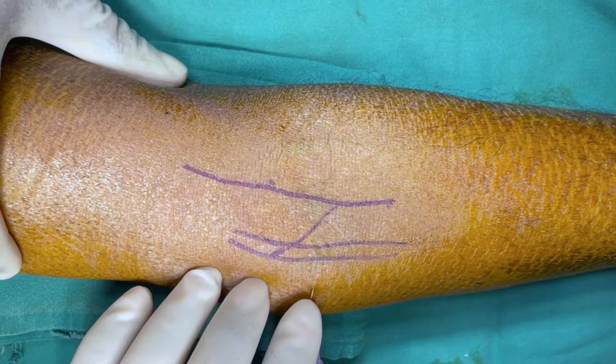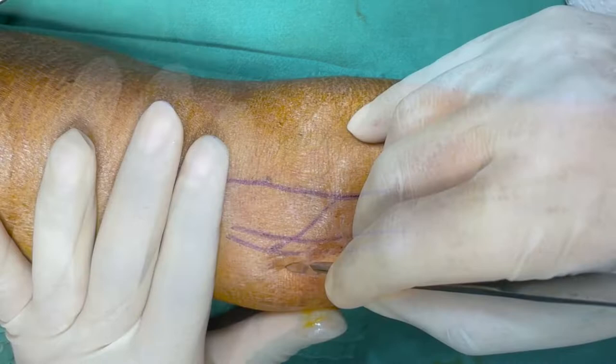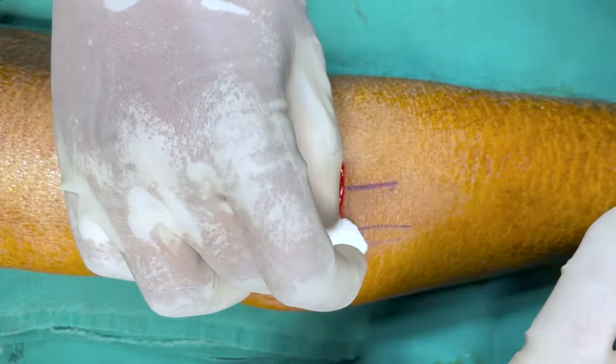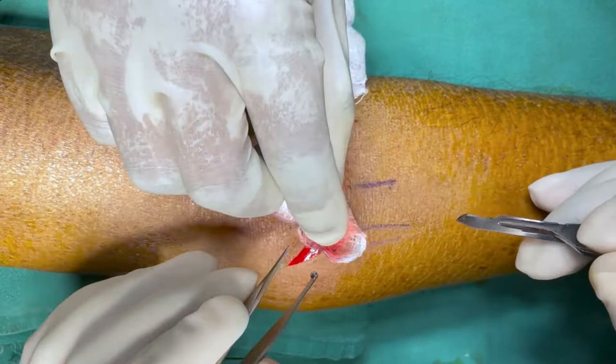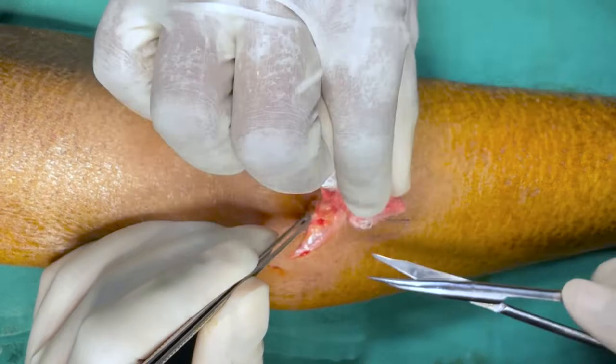Then infiltrate with 2% lignocaine. Make incision with a number 15 surgical blade just below the cubital crease. Then the incision is deepened.